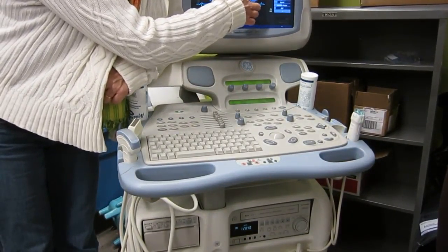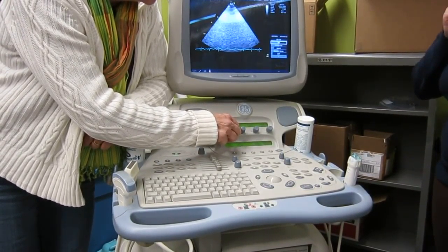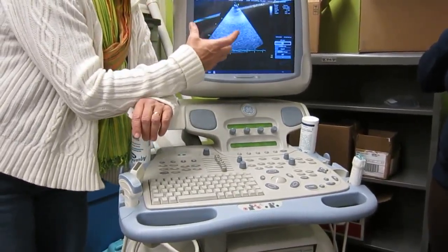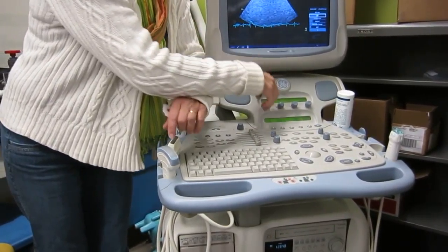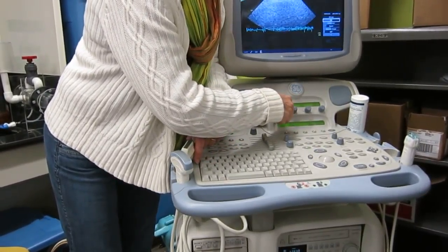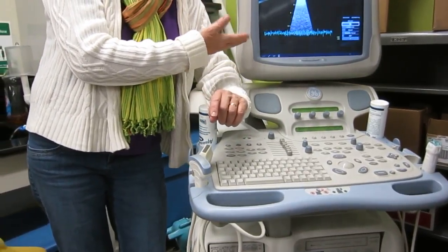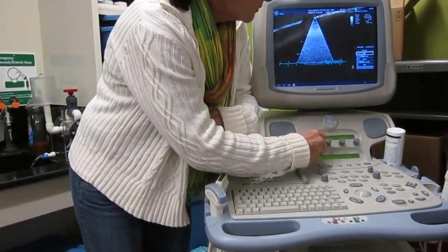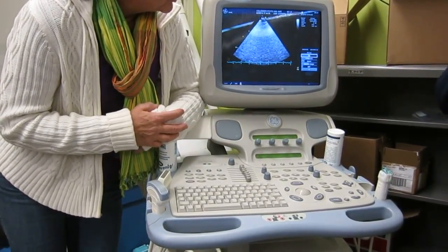This is the width of your color sector, so we can go wider or a little smaller. Where it's defaulted is a pretty standard one. In the abdomen and your carotids, we're going to go wide because you want that nice wide field, and you don't care so much about frame rate. If I go wide here, see the frames per second are 64 essentially, and as I go narrower, see how the frames per second go up, because it doesn't take as long to process that width as it does for a really wide one, right? So this is so small we don't see what we want. Something in that range right there is adequate.